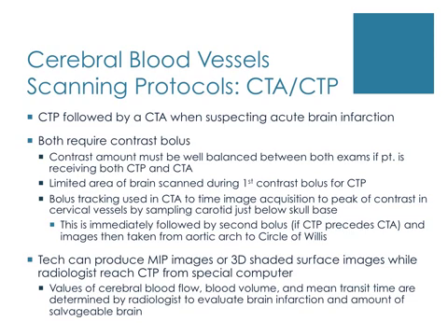the radiologist evaluates the CTP study using separate software provided by the manufacturer. Values of cerebral blood flow, blood volume, and mean transit time are determined by the radiologist to further evaluate the brain infarction and the amount of potentially salvageable brain.